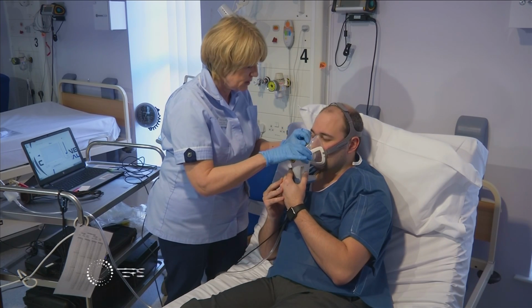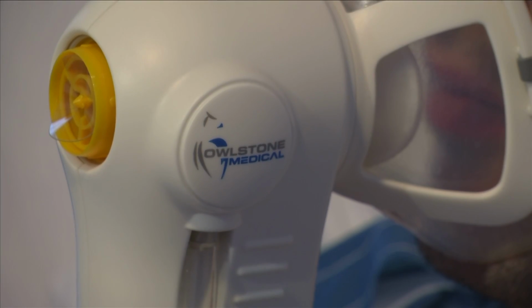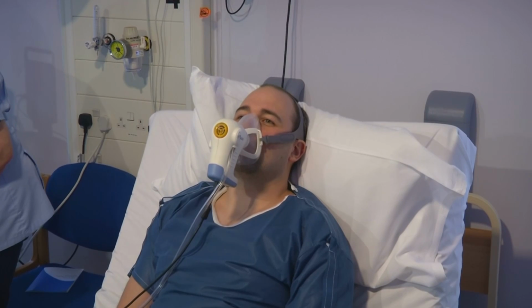A simple breath test could soon help doctors detect the early signs of lung cancer. The sensor inside this breathalyzer measures minute chemical traces in a patient's exhaled breath, which could be a biomarker for cancer. The challenge is most people present when it's very late stage, and it's about managing symptoms as opposed to curing them. So the key thing that you can do is detect the disease early, and that's what we think the breathalyzer technology allows for, picking it up at that earliest stage when it's treatable.